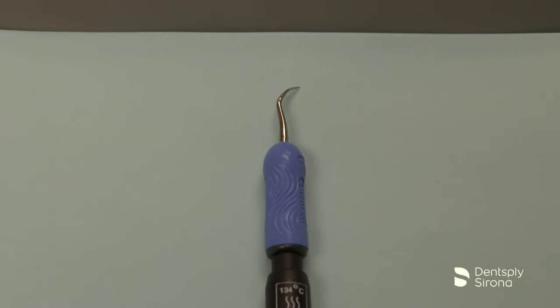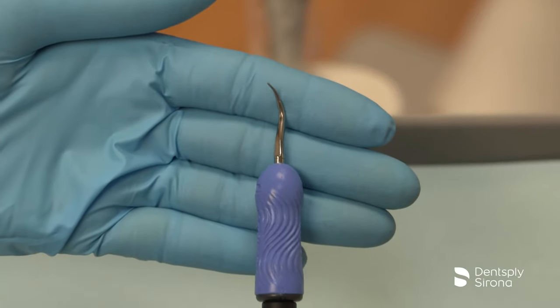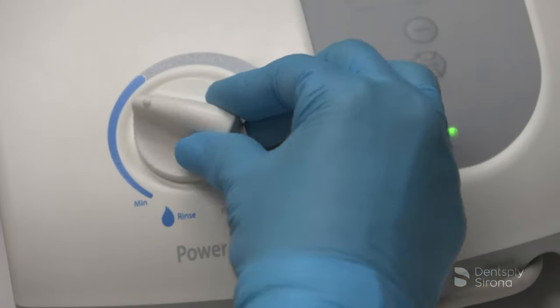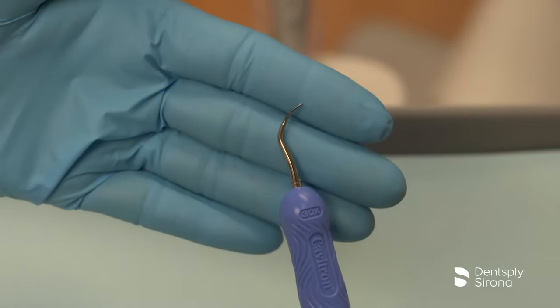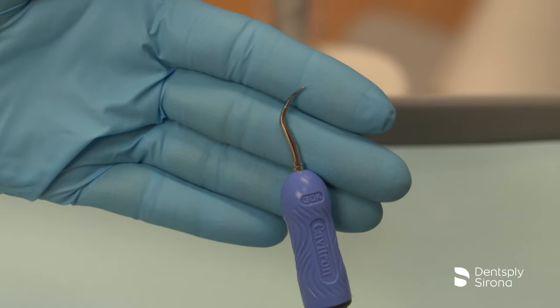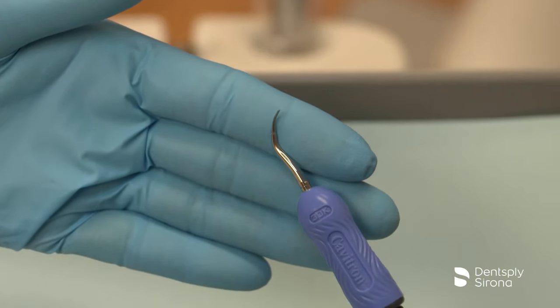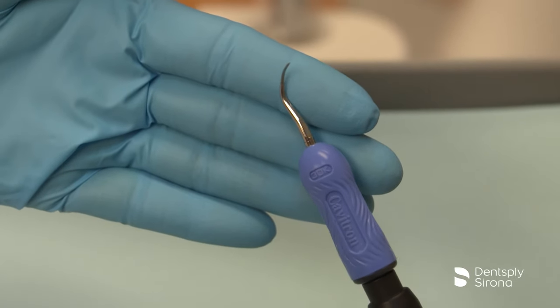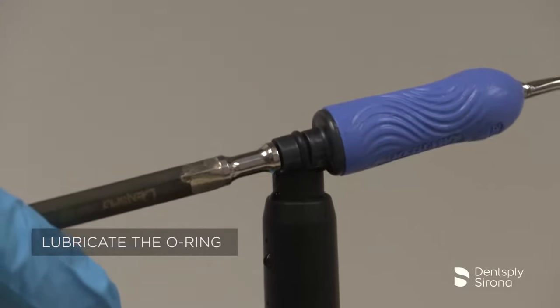This is the Cavitron FSI-1000. It is designed for removal of moderate to heavy deposits and can be utilized at all power levels. The Cavitron FSI-1000 has a triple bend and in cross-section is shaped like a square. Energy is dispersed from this design in a more powerful way due to the cornered cross-section, aiding in effective removal at the line angles and interproximal surfaces.